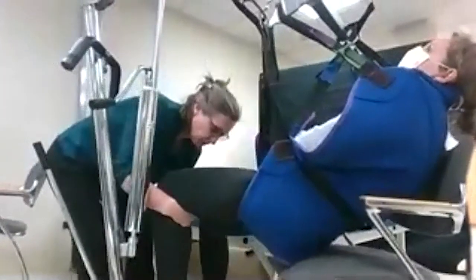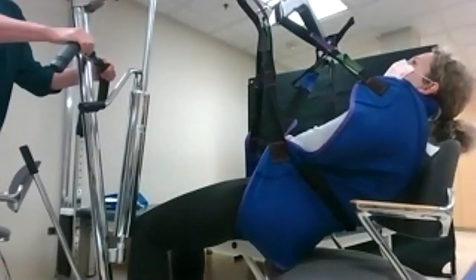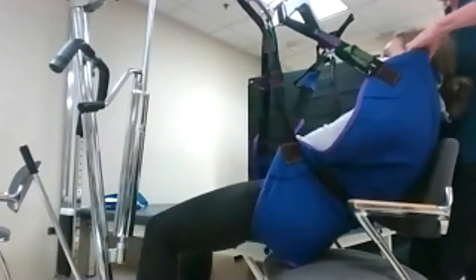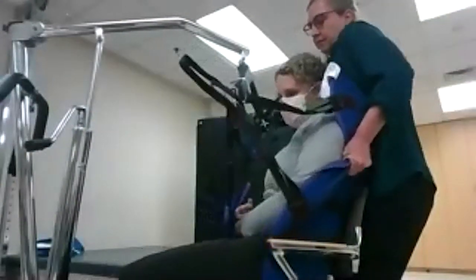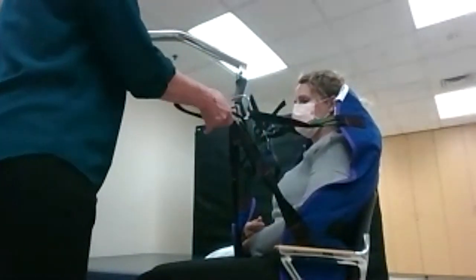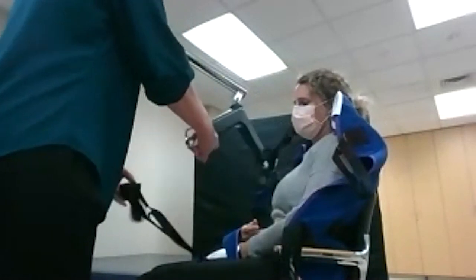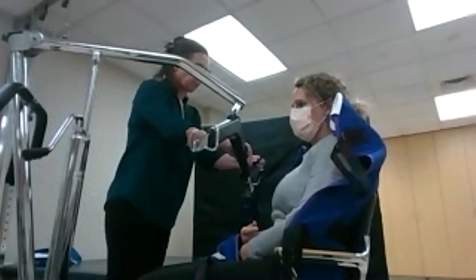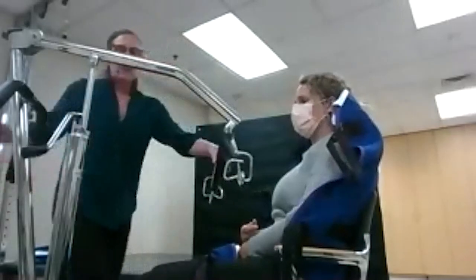You want to make sure that you're high enough that you're over the chair, and I would have her a little bit tighter on her shoulders. I'm going to lock the lift system, walk around towards the wheelchair or whatever you're trying to get them to, lift them up, and put the chair underneath. Now slowly lower with the release mechanism — and maybe one more shift to pull them back. Now we're in the chair. I recommend that you release all the resistance in order to undo the sling. Sometimes it's not worth fighting with the sling on and off all day, so some people choose to stay in their sling, because then you're ready to go to the bathroom, another chair, or a lounge chair.